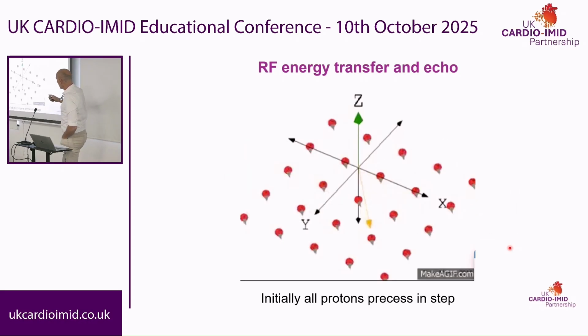So I should say initially that all the little protons will spin like soldiers walking in step. So all of them will go around in synchrony, all of them. And that's really important when we come to talk about T2. So bear that in mind.